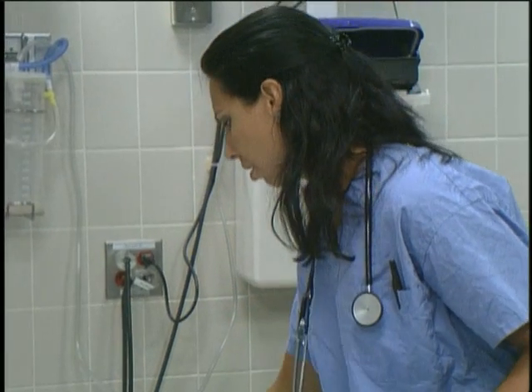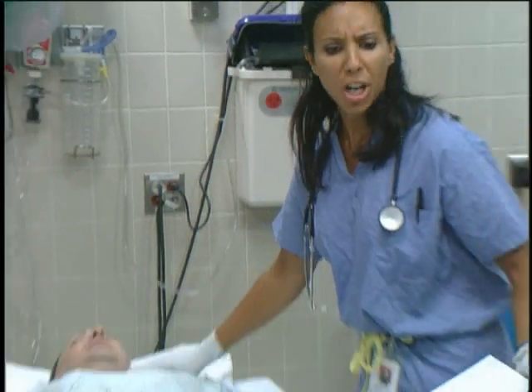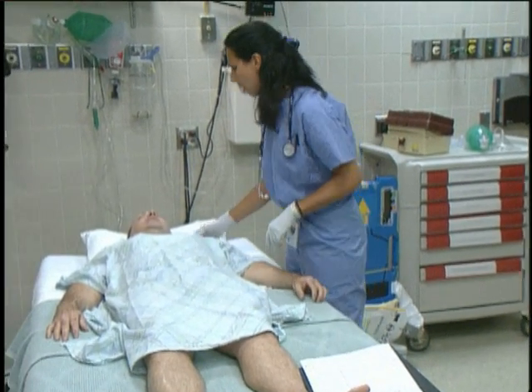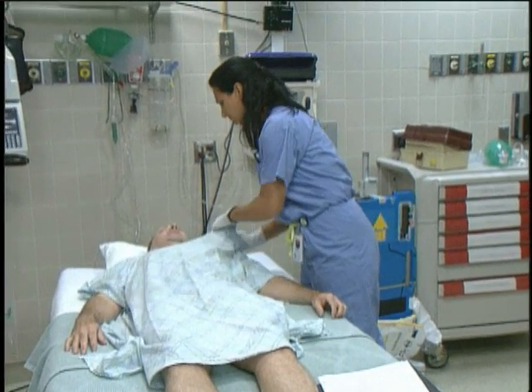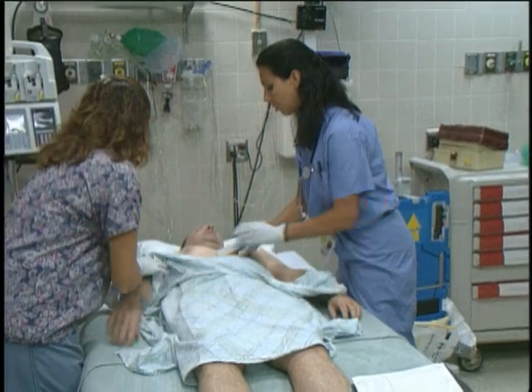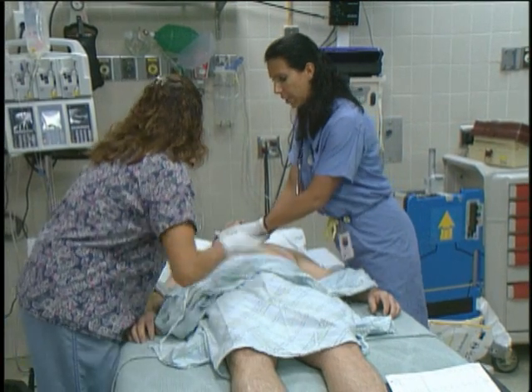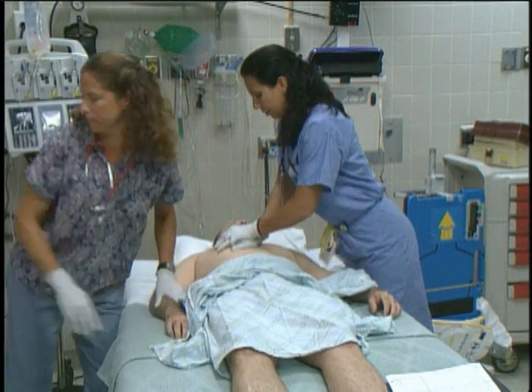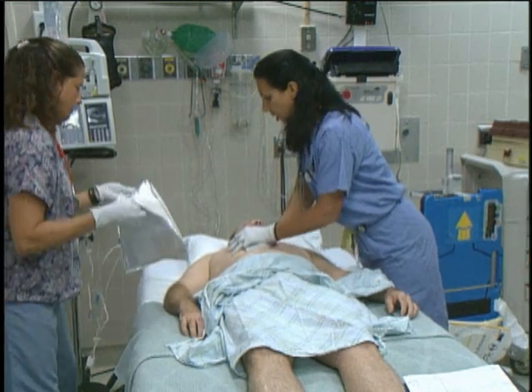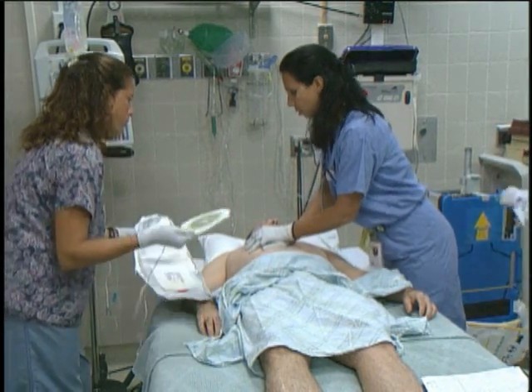Mr. Spinetti? He has no pulse. Jen, call a code. I need help in room three. Let me give you a hand. I'm going to start CPR. Can you get the defibrillation pads on? I don't know what happened, Jen. I was getting him signed up to go home, and I came in and he was blue.